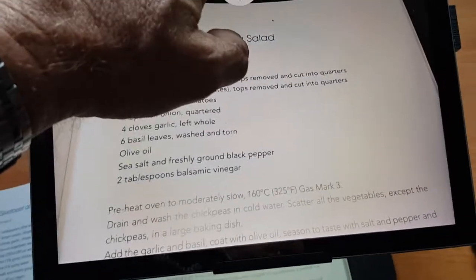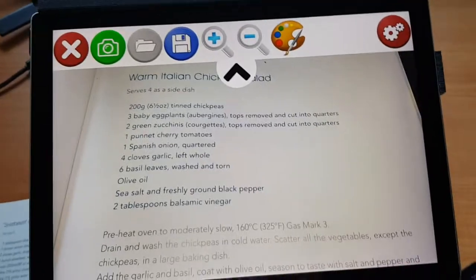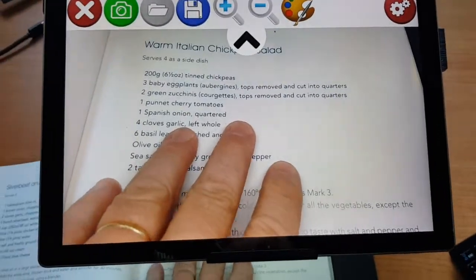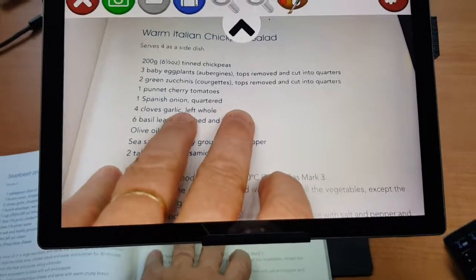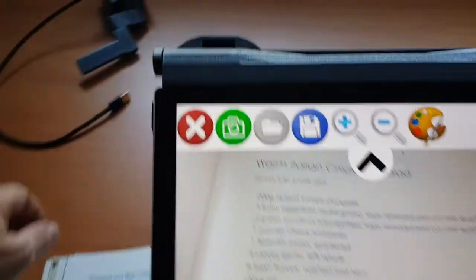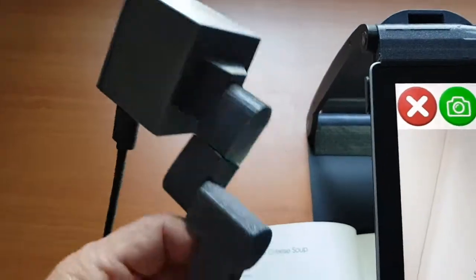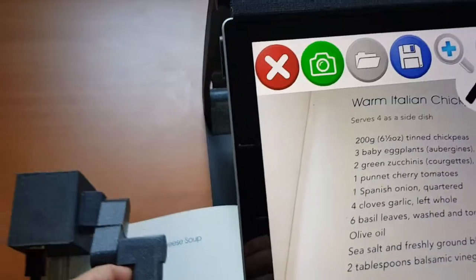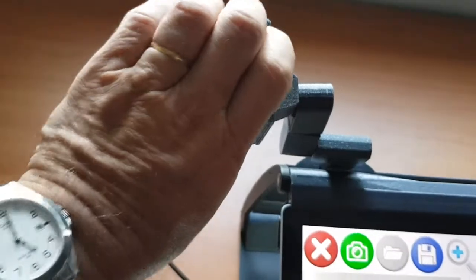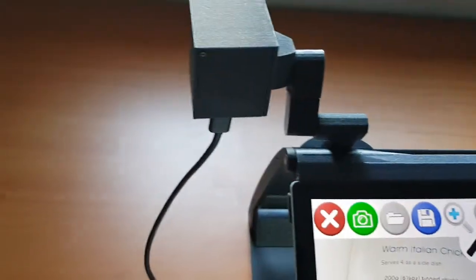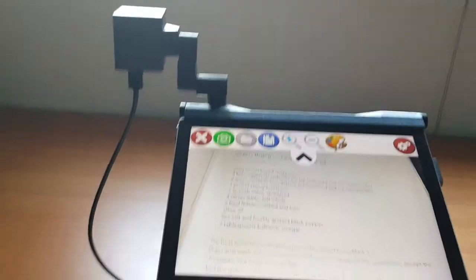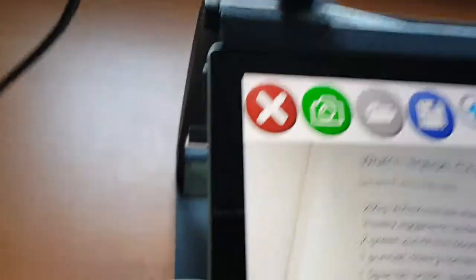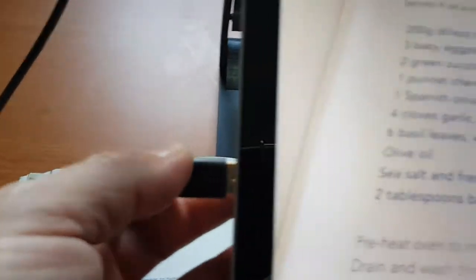Now the other function of the Mercury 12 is that aside from reading close-up materials, documents and so on, books, coursework, you can also attach a distance camera as well. So this distance camera slots into the slot here on the top, like this. We then connect it via USB into the side of the Surface Pro.